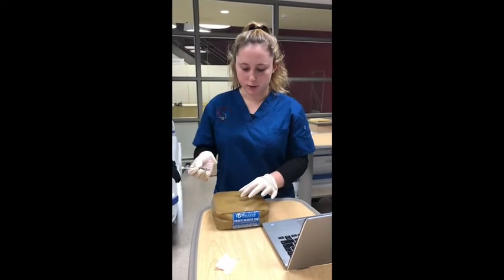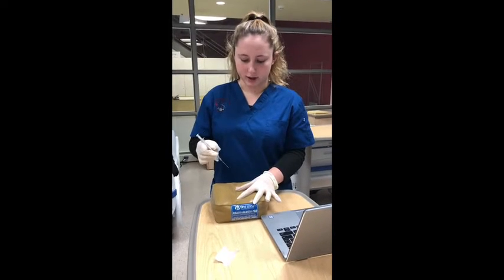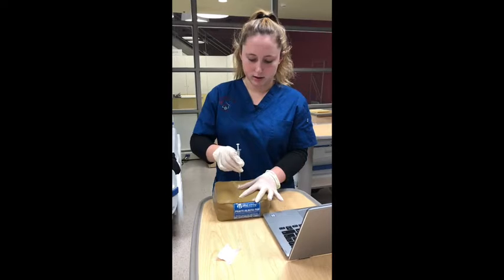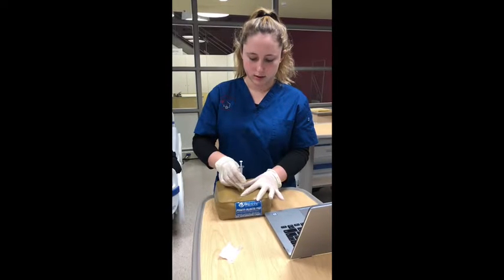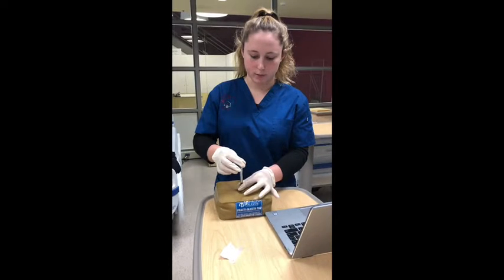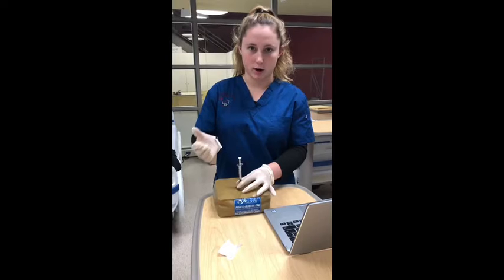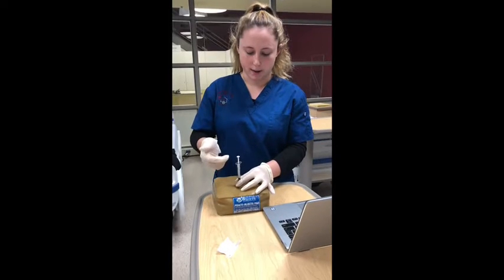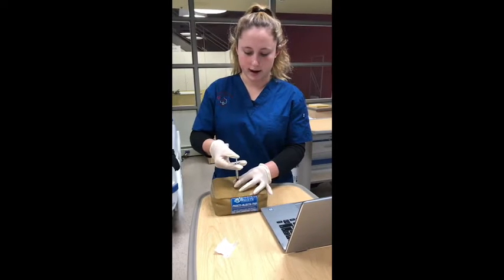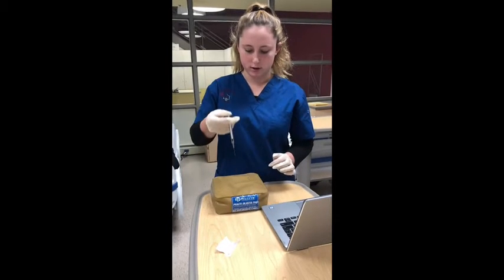So first I'm going to pull the muscle taut, and then I'm gonna go in at a 90-degree angle. I'm gonna stabilize my needle, and then what I'm gonna do is I'm gonna pull back a little bit just to make sure I'm not getting any blood, which would indicate that I'm in an artery or a vein. And I'm not getting any blood, so I can go ahead and inject the medication into Mr. Mancini and remove the needle.